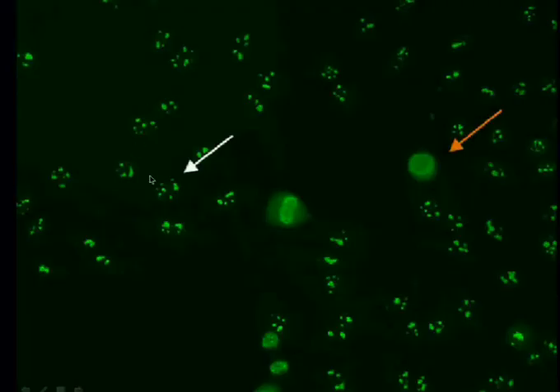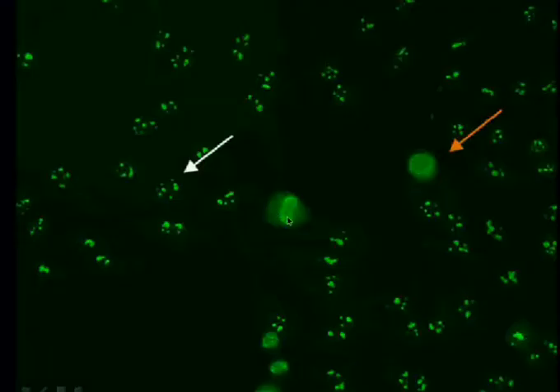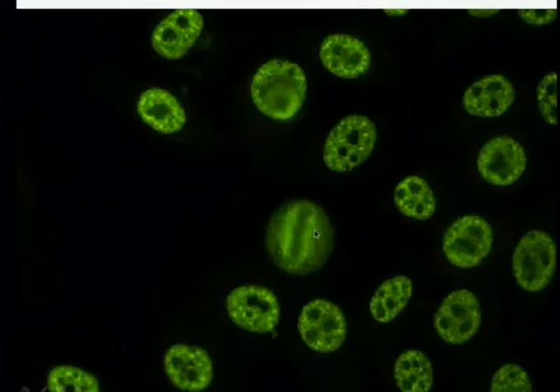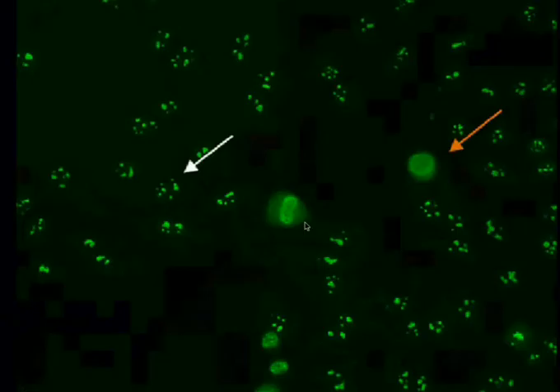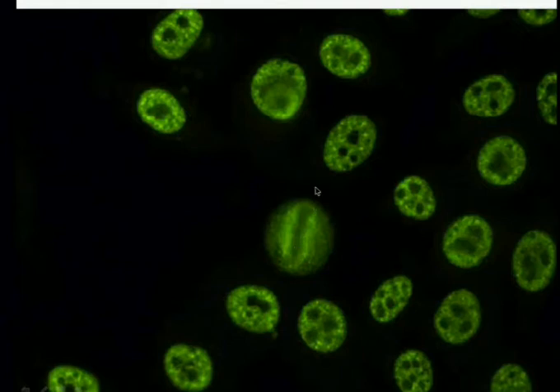Then there are antibodies to RNA. Then there is the anti-centromere pattern. This anti-centromere pattern looks somewhat similar to the speckled pattern. Then how can we distinguish? Look at the mitosis. It is stained here, but in the speckled pattern the mitosis is not stained. Here mitosis is stained and it looks somewhat speckled, but it is the anti-centromere antibody. So anti-centromere antibodies look like this, and the mitosis is also stained. But in the speckled pattern, mitosis is not stained.